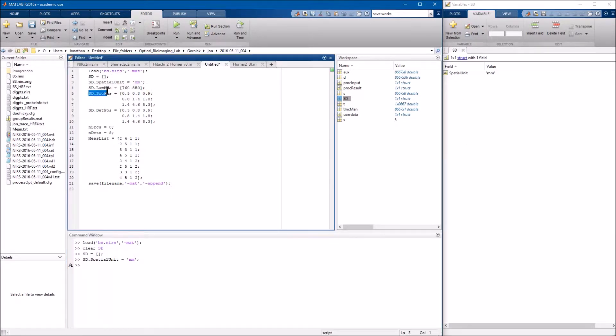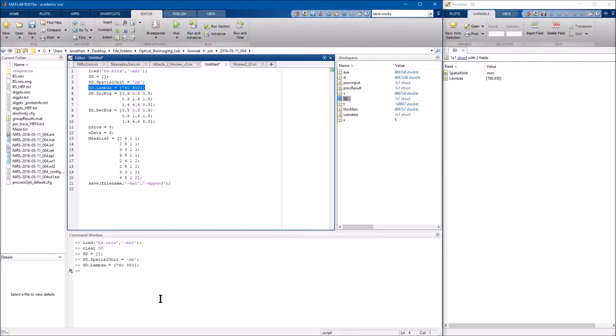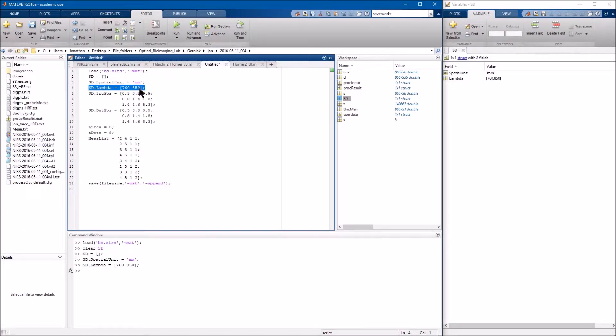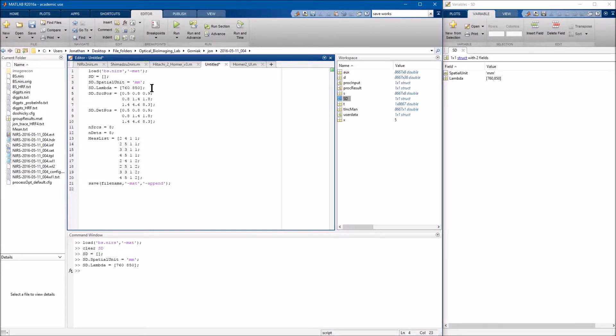So the next down is going to be the sd.lambda, which is going to be your wavelengths. So depending on what system you have, these wavelengths will probably be different. I'm working with the Nerex NereScout, which has 760 to 850 nanometers. But many other systems will have different wavelengths. So make sure that you have that correct. In the Nerex system, you would be able to find that in the header file, the .hdr. I'm sure the other systems as well have either in the manuals or in a similar file.